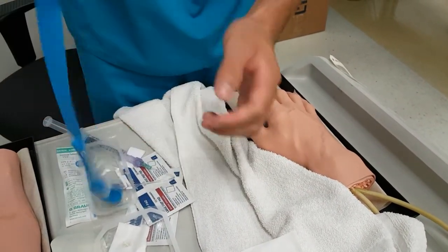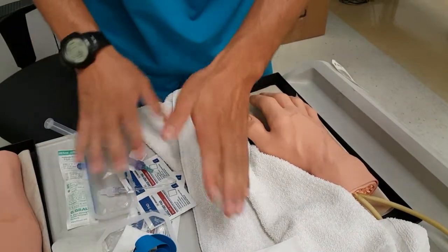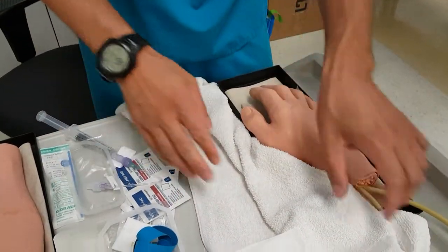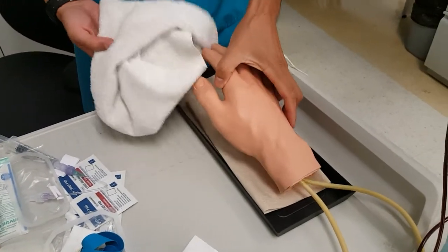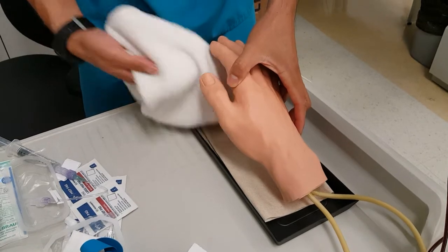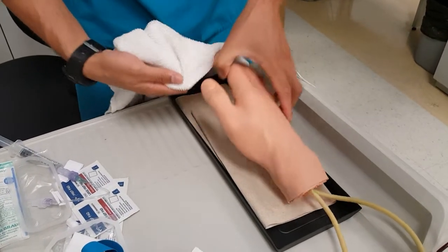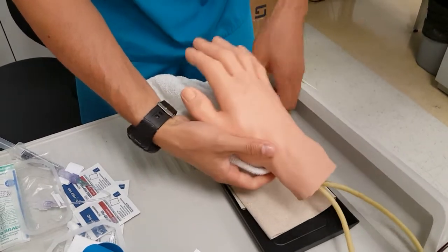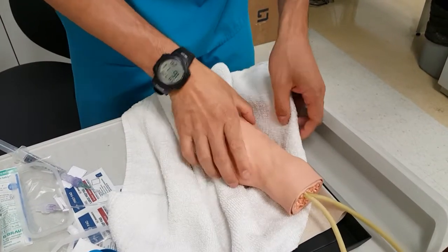I'll just loosen up my tourniquet. I've got pretty much everything ready. Now I'll go to the patient — obviously introductions have been made. For this example we'll be doing it on the hand, so I'll put the towel right under where I'm going to be inserting.